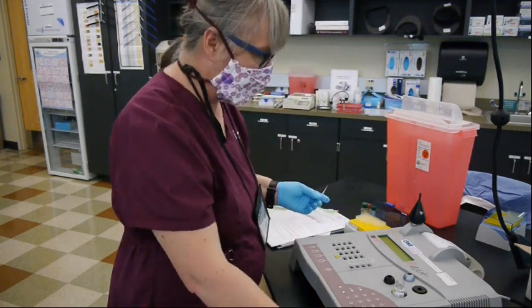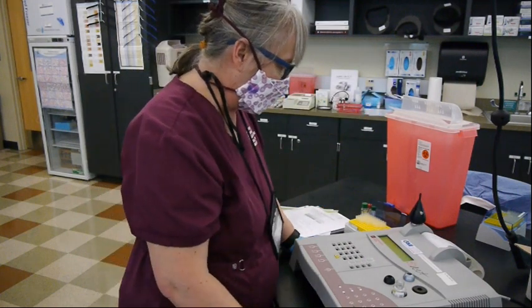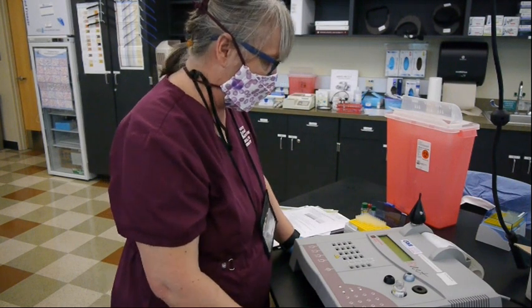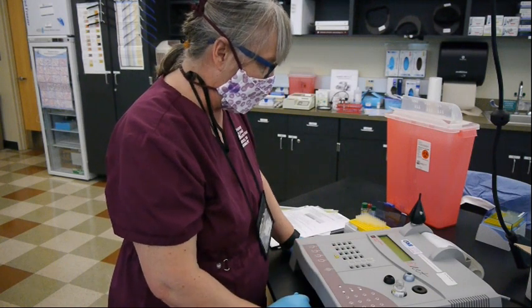And again, this is testing a different part of your cascade, so it just naturally takes longer to go through the clotting process in order to get a clot and stop that bead from going back and forth.